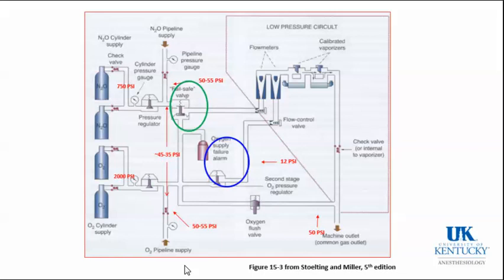And therefore, you'll get no alarm even if you've lost the pipeline until the tank goes empty. And then the patient and you are in big trouble. So that's why it's very important that the oxygen tanks be closed at the start of the case.